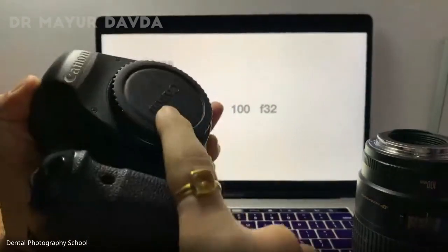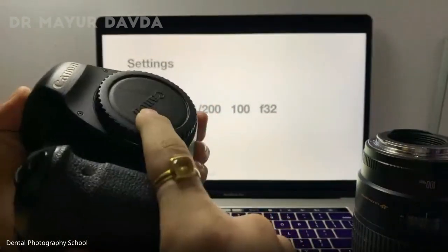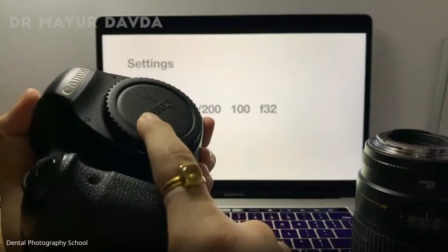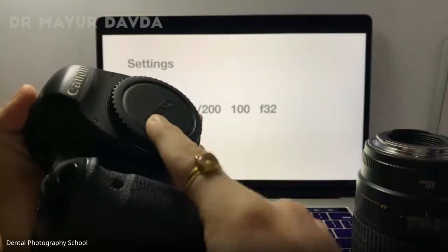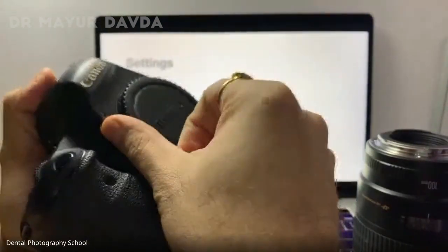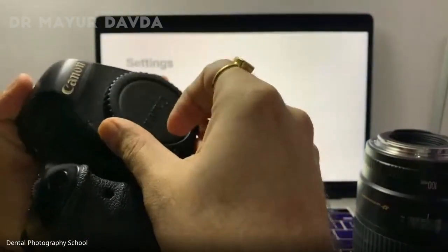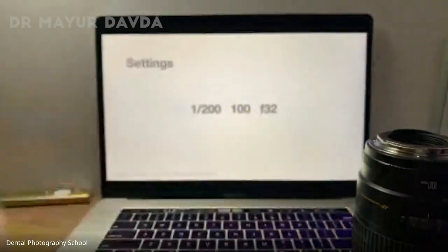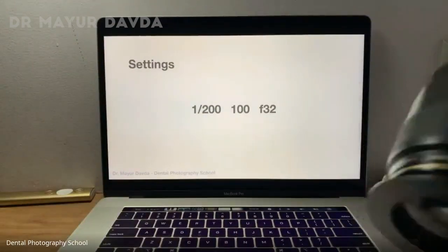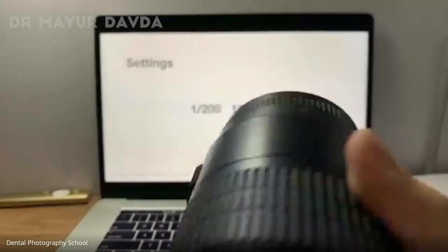But as soon as this comes off, dust particles are going to go inside. So I have to protect it from dust going inside. So I'm just going to cover it with my clothes. So you'll not be able to see the camera in the moment I attach the lens on it. So I've removed the camera cover, and I'm going to be attaching my lens onto my camera.